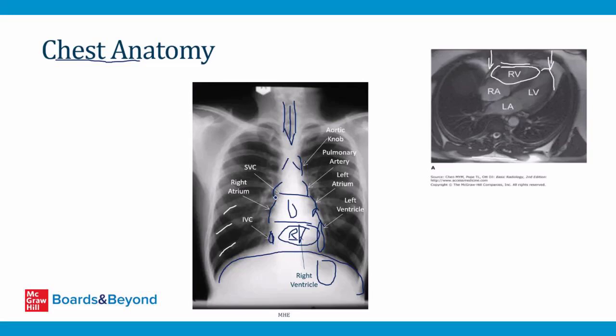And so once again, I can't emphasize this enough. It's very hard to get good at reading chest x-rays until you do it every day as part of your job.